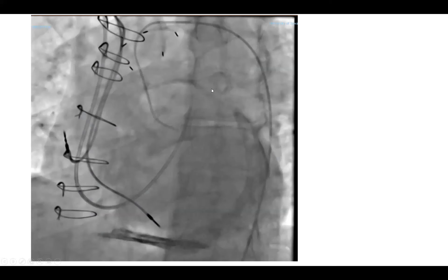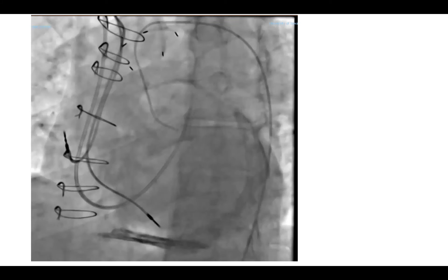This is a chest X-ray fluoroscopy image showing heavy calcification of the pericardium, which by itself is very suggestive of constrictive pericarditis. You don't often see heavy calcification — it's rare, maybe 20% of cases. The more uniform anatomical feature is on CT: pericardial thickening — 82% of constrictive pericarditis have pericardial thickening, which is defined as a pericardium equal to or over 3 millimeters on CT. It's a supportive feature.